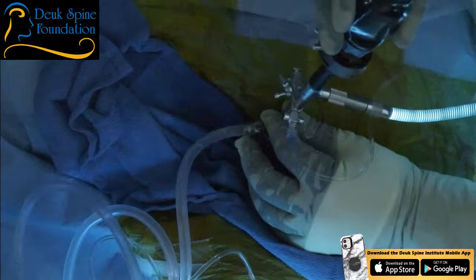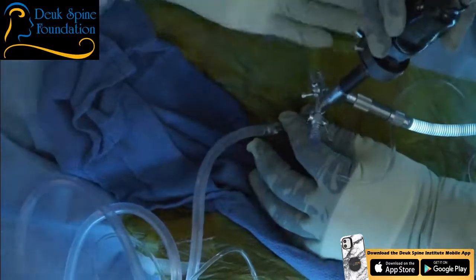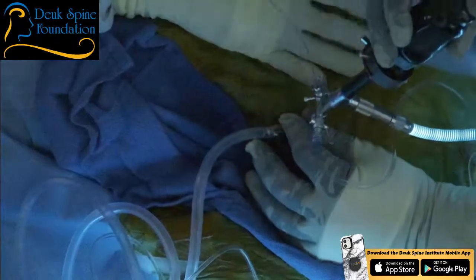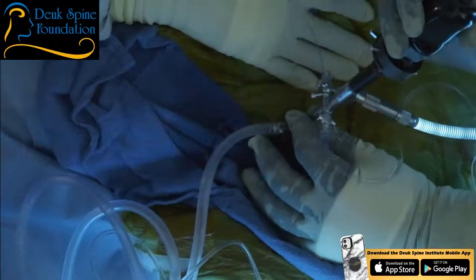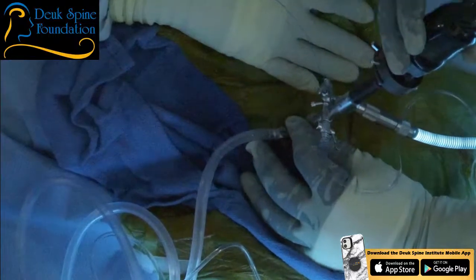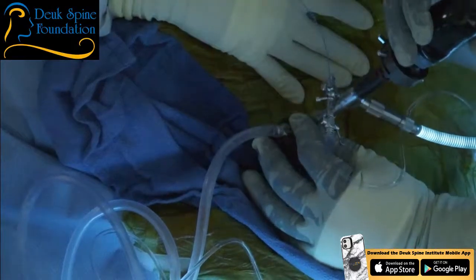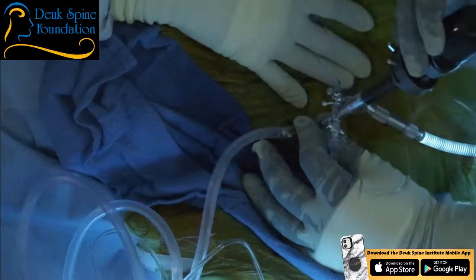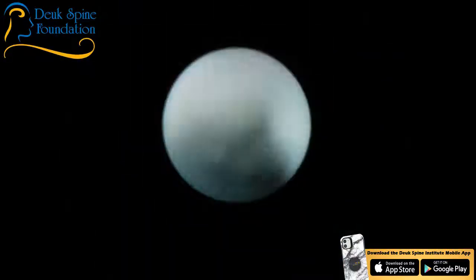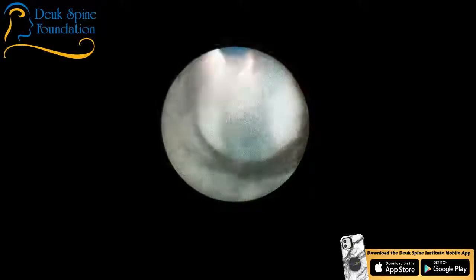The laser is really good at freeing up the herniations, getting them loose, because a lot of times they're scarred down to the annular tear. They're scarred down to the end plates. They're scarred down to the posterior longitudinal ligament. There's the foraminal herniation right there. Okay, that's the foramen, the neural foramen. Beautiful. There's a piece of herniation that was in the foramen, floating out. We call those floaters.